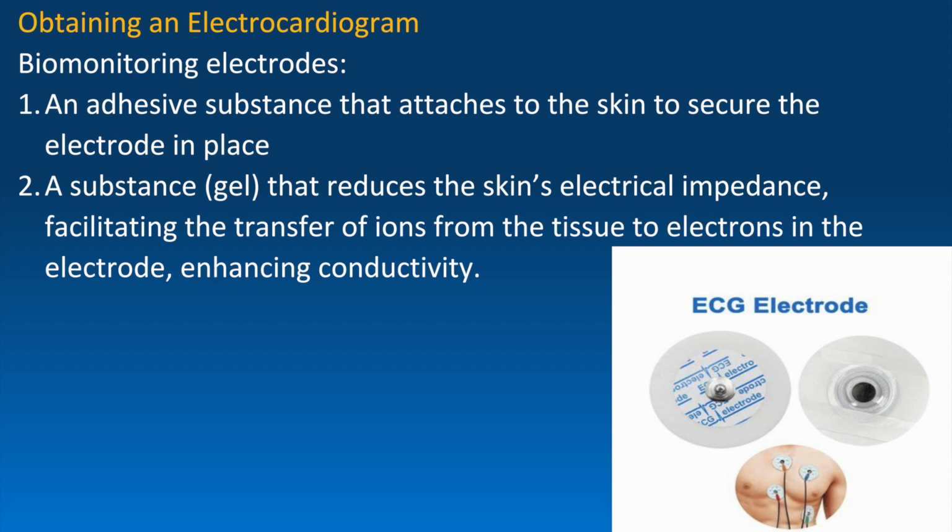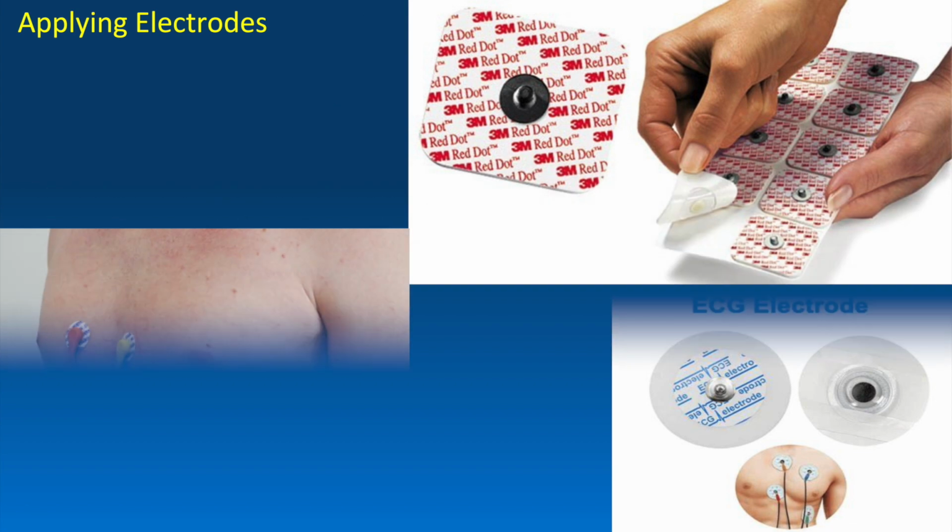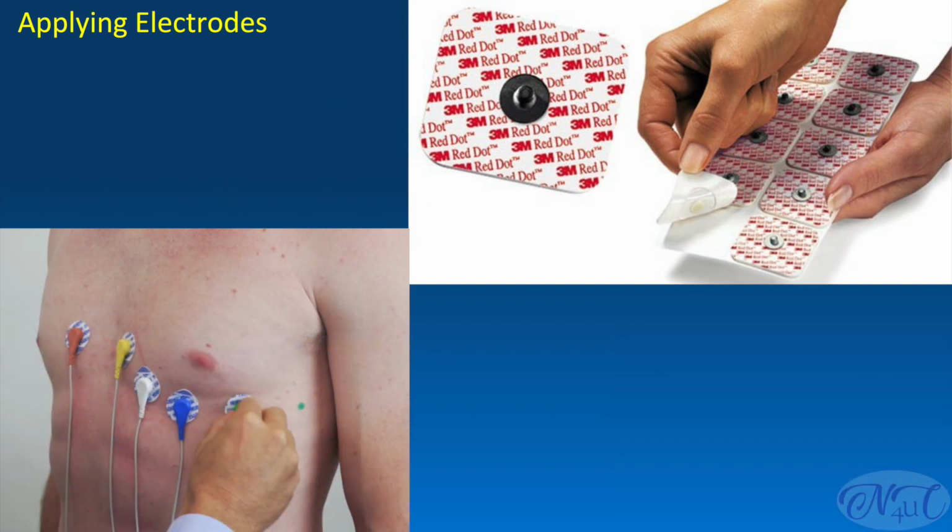An adhesive substance that attaches to the skin to secure the electrodes in place, and a substance that reduces the skin's electrical impedance, facilitating the transfer of ions from the tissue to electrons in the electrode, enhancing the conductivity. Now let us see how to apply the electrodes.